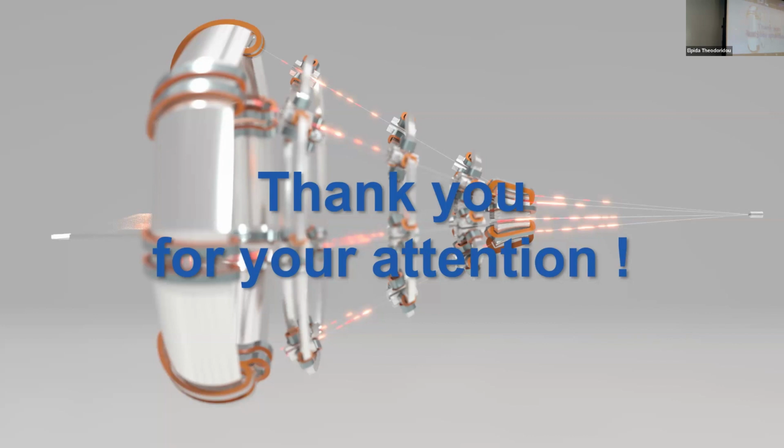Hi, there's another question. In the conventional proton gantry, when you rotate the gantry, the assumption is that you should shoot into the isocenter with a precision of about 1 millimeter. And if not, there are some corrections done for each degree of the gantry position. How do you think in this magnetic gantry, which is really fantastic, what would be the reproducibility of shooting with such a precision? Is it realistic to get such a precision?